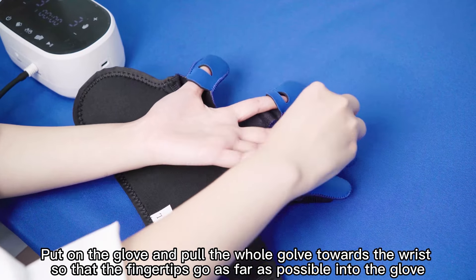If you choose the PG-02 power glove with valve knobs, you can switch the valve on the glove according to the training demands, so that the affected hand can be passively trained with one or more fingers.